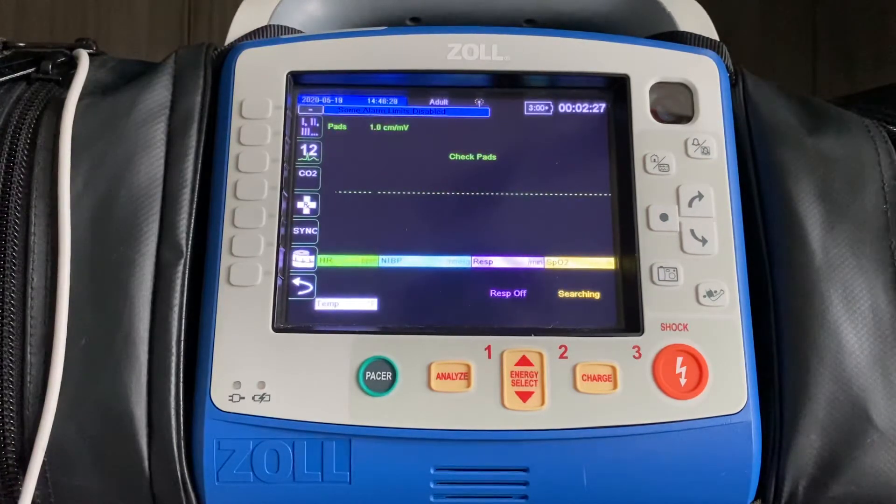But our perfusion index is going to help us make sure that's the case. For example, I'm left-handed, so I would put it on my right ring finger.